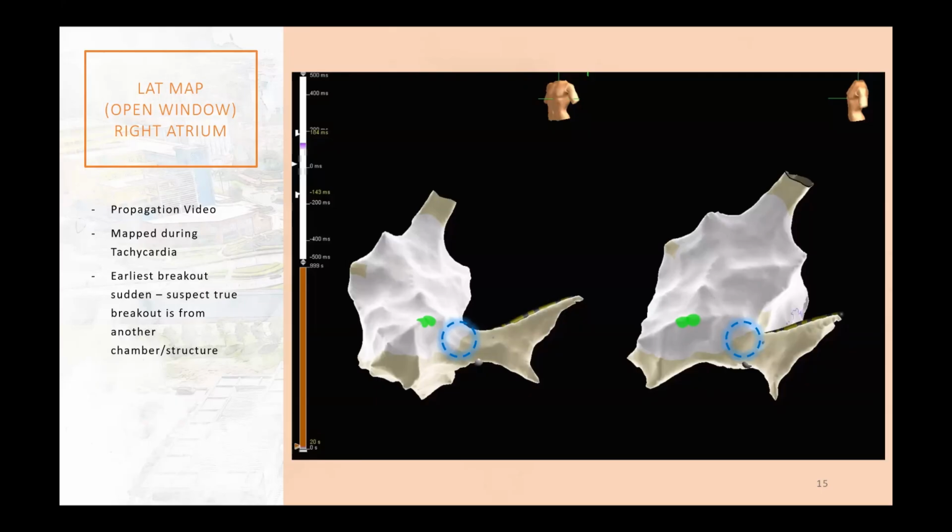So if during the ablation the impedance is going high, what should we do next? Change to the irrigation catheter? I think first of all, for a posterior septal pathway, most likely irrigation is better than non-irrigation. The reason is, if you do a resistive burn in the vein, what happens to the vein?